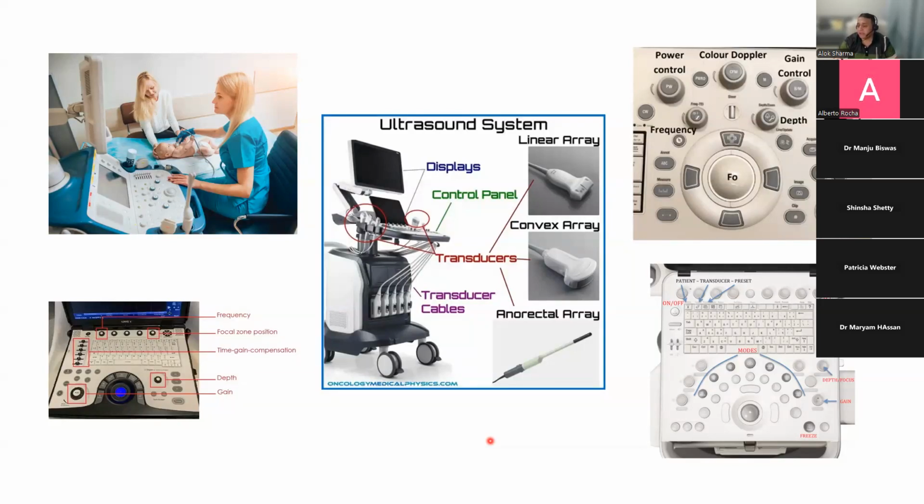Now, just remember that when you use the GE machine or the Sonosite machine, you should press it twice. The reason is that when you take a probe with gel and put it on the baby, let's say on the baby's head, some machines are automatically set to use the preset gain settings. But more importantly, when you press auto gain, they will adjust the settings from the original presets, and you might have to press the button again to get appropriate gain.